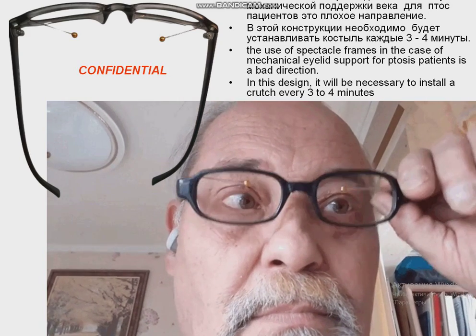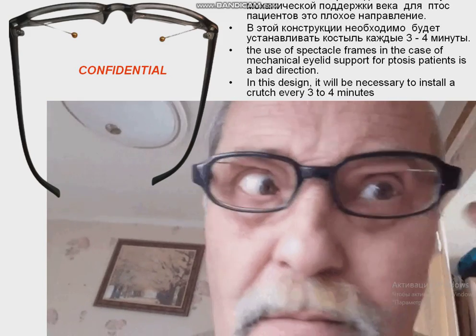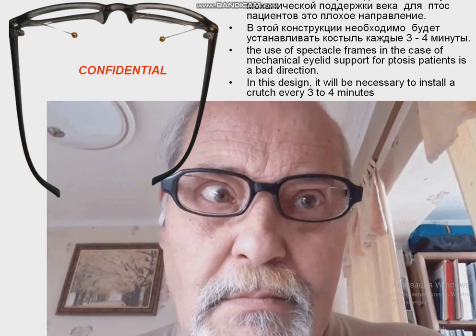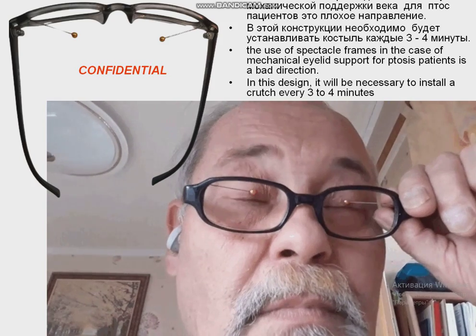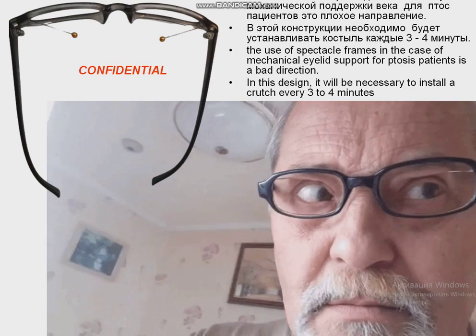Application of a frame for glasses is the wrong direction, because in this case it is necessary to change the position of the frame every 3 minutes, because after 3 minutes you will get some pain and a bad feeling in the eyelid area. How can we solve this problem?